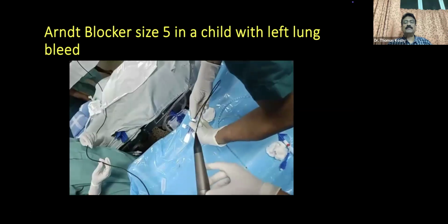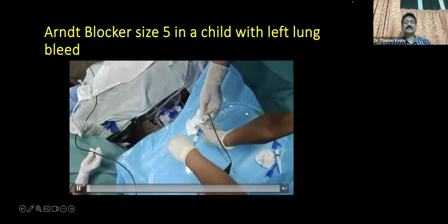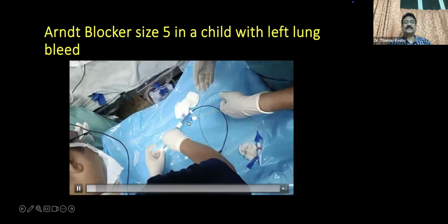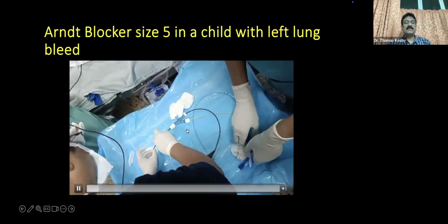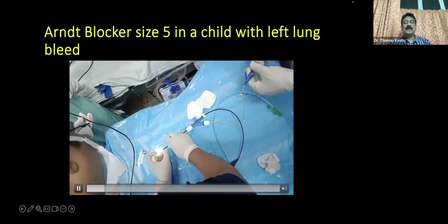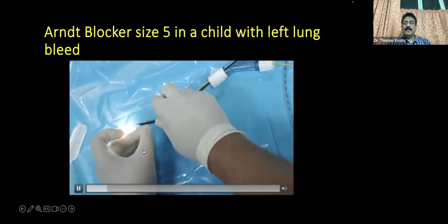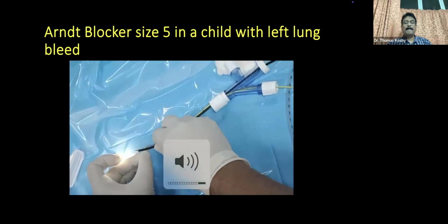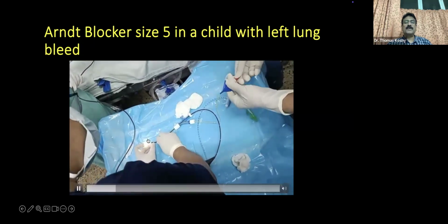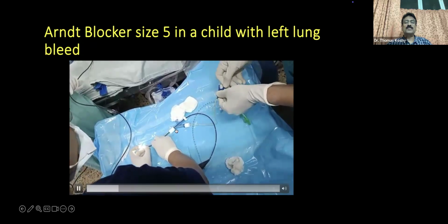So this has got a multi-port adapter. This is myself and my colleague, Dr. Unnikrishnan. We are putting this. The patient is already intubated. And this is a multi-port adapter. You can see that the blocker is going through this port.